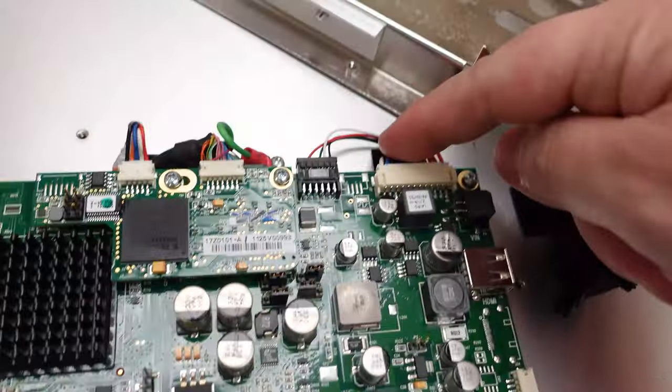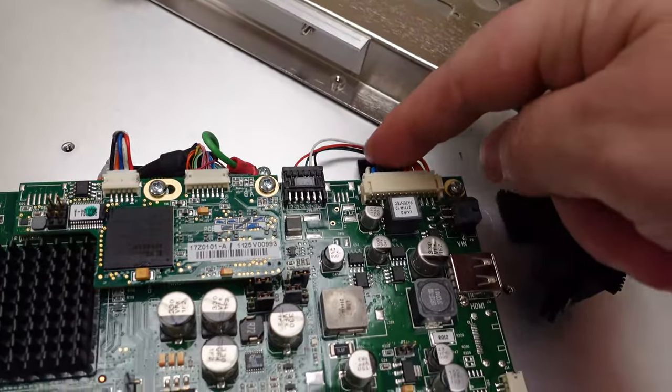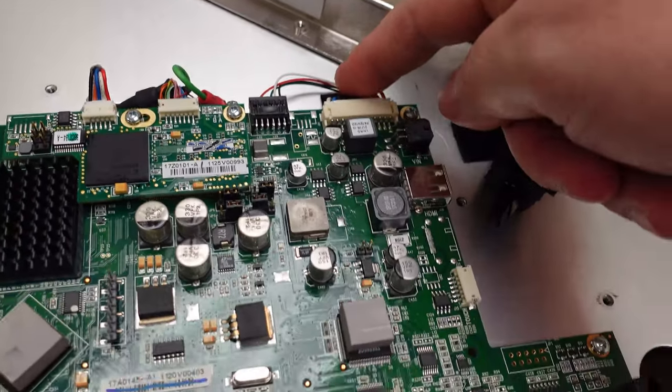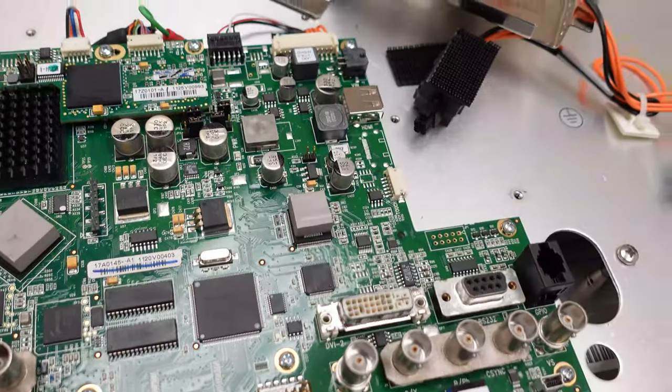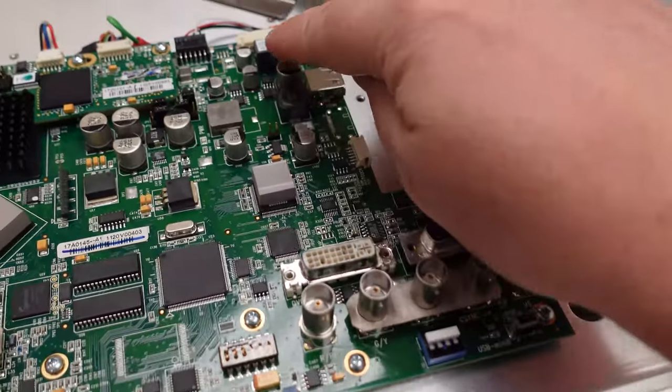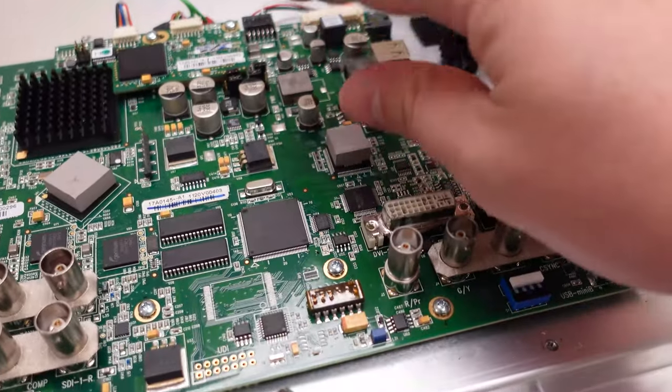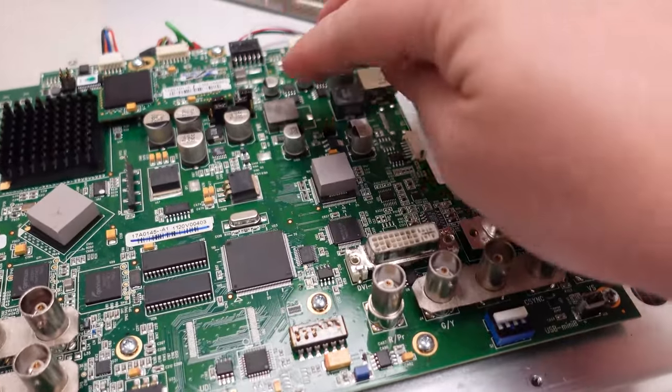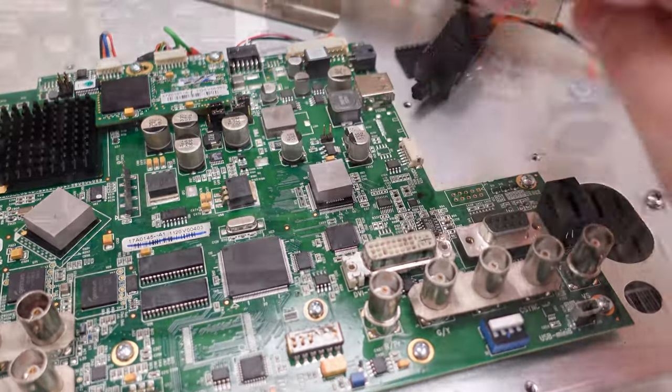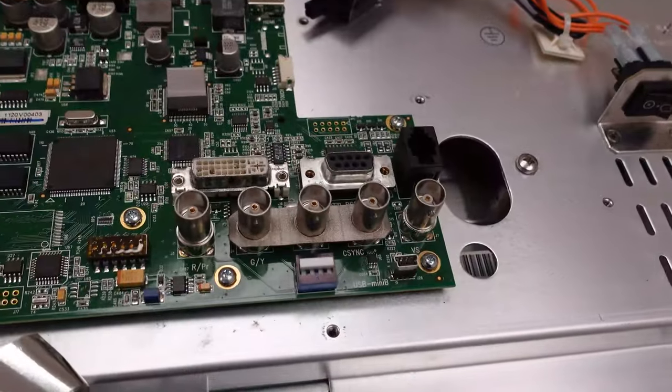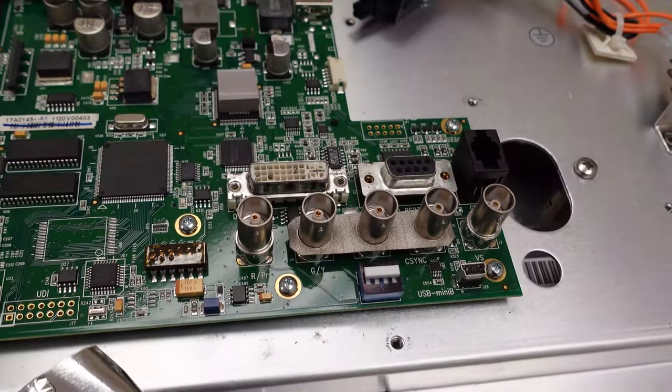This one right here is your power that goes in for your backlighting. You see all this stuff going on over here? This is for your LED backlighting. You can see it's actually a very simple board.